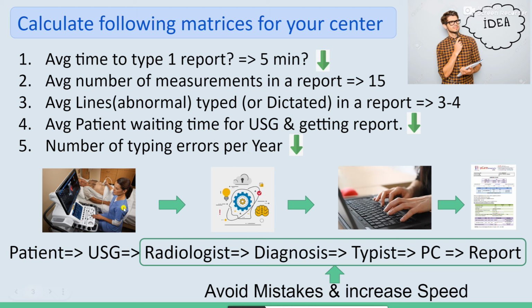Now let us see exactly what the radiology workflow is. Let's first understand it, and then we can think about where we can improve it. The sonography machine acquires the images of the patient, and the radiologist sees those images, and from his or her sophisticated brain finds the diagnosis. After the diagnosis, either he conveys it to the typist, who types it into the computer and prints the report, or the doctor might type it himself into the computer and the report is generated.